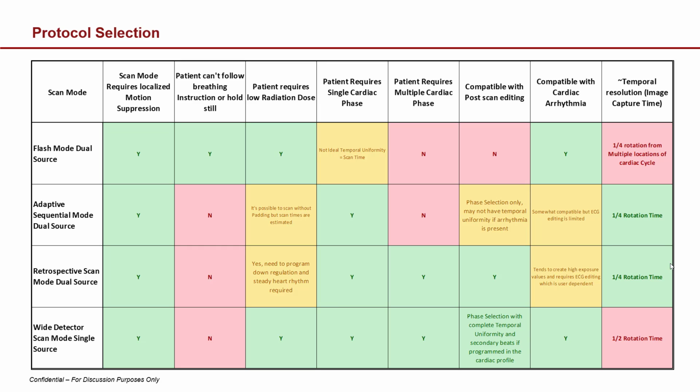In fact, you don't have to put several heartbeats together. I've got an example of that I'll show you in a little bit. The wide detector works very well with cardiac arrhythmia.